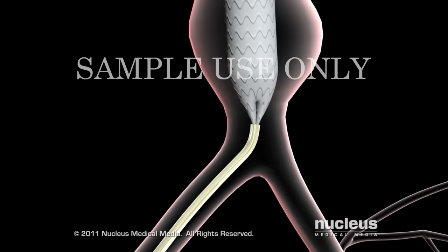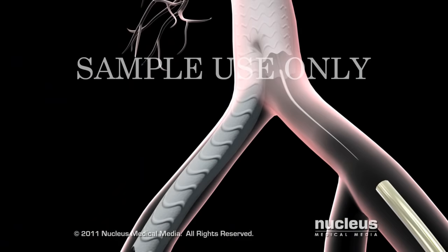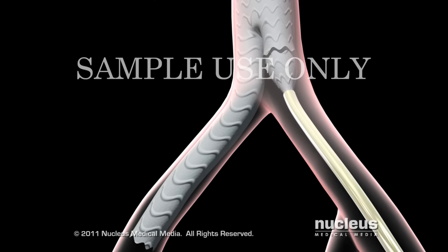Then he or she will open the graft, which will be held in place with metallic hooks and stents. Your surgeon may insert additional graft components to extend the graft into the blood vessels supplying your legs.